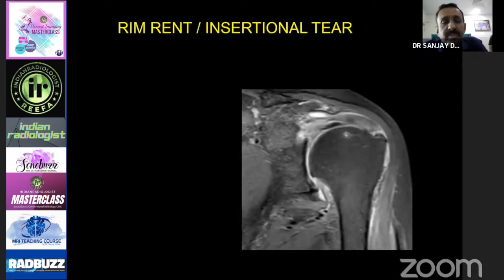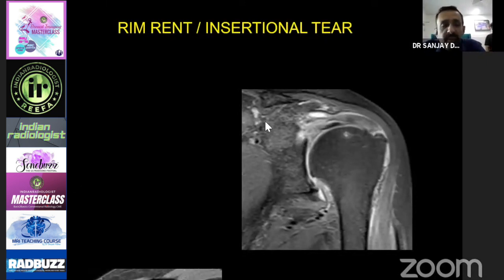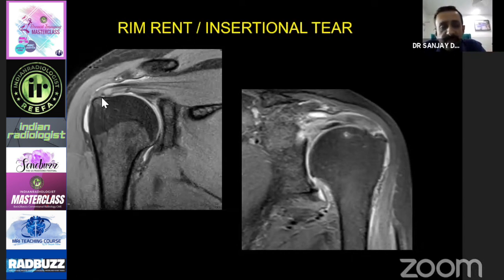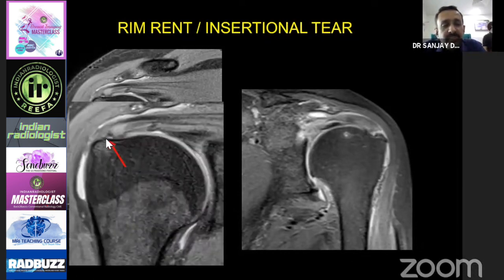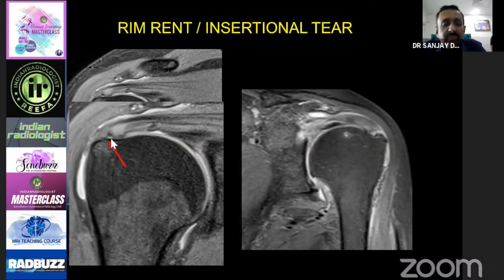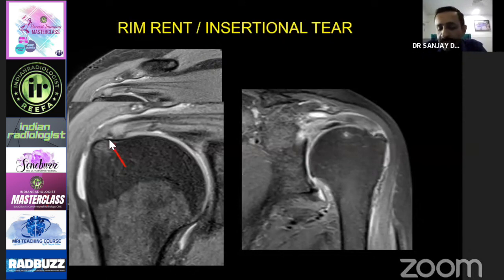There is something called a rim rent or insertional tear. Insertional tears can be full thickness or small and partial thickness — you need to identify these by enlarging the image. This is an insertional tear not involving the bursal or articular surface with no retraction — so this is not a PASTA tear and not an avulsion tear, but a very small focal tear at the insertion. That is called a rim rent tear or focal partial thickness insertional tear. Sometimes they may be complete, sometimes partial.